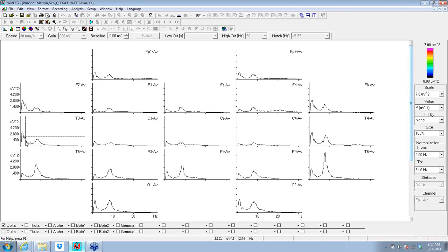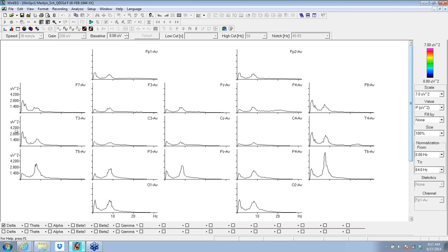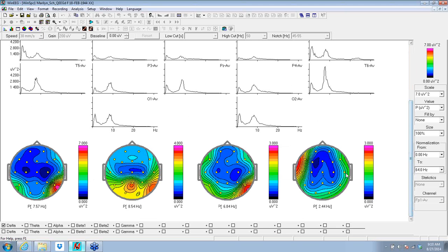And there's even slower content that's not just the high rise of the slow edge of the spectra. And that slow content ends up being seen in the frontotemporal areas. Again, that's not lateral eye movement.